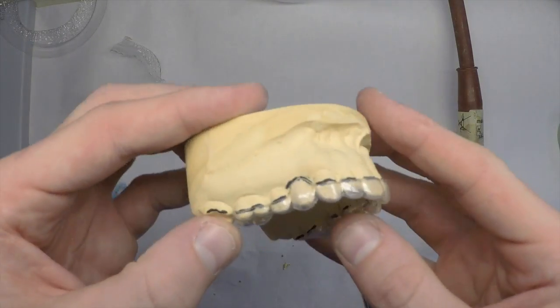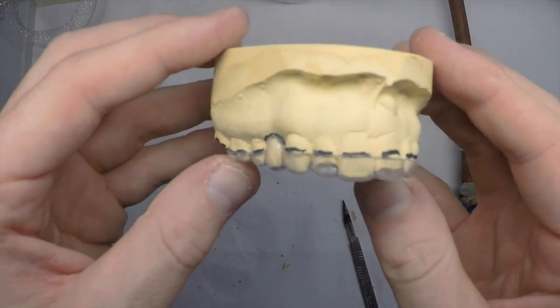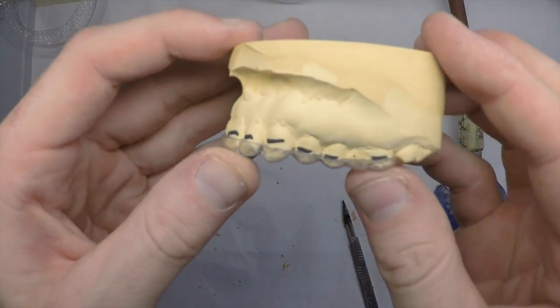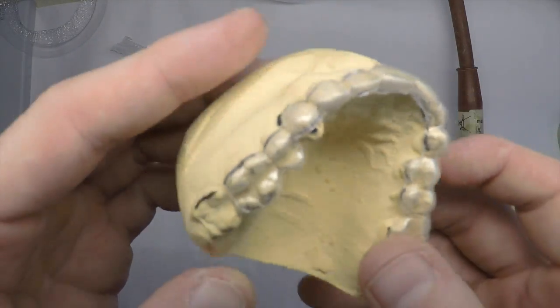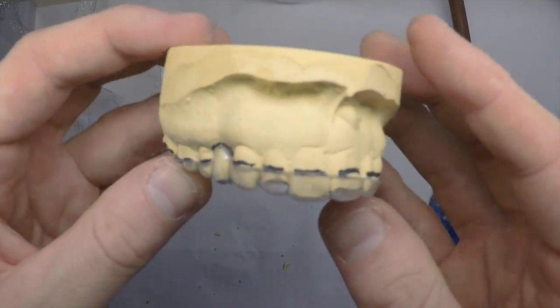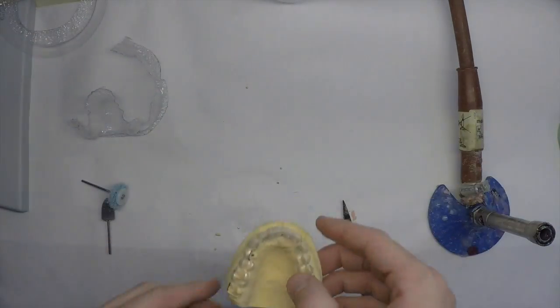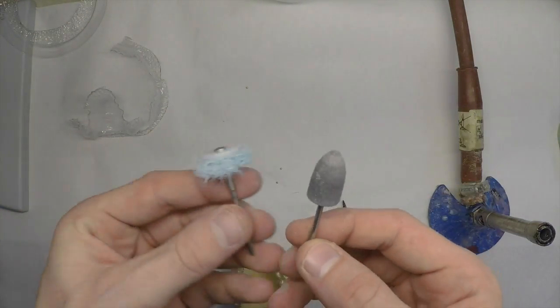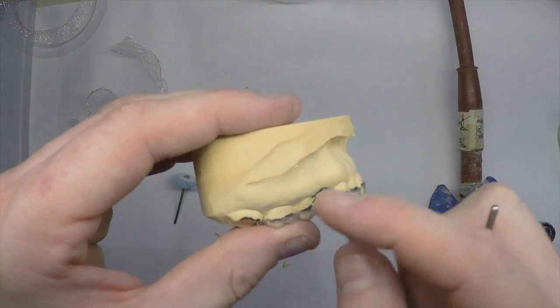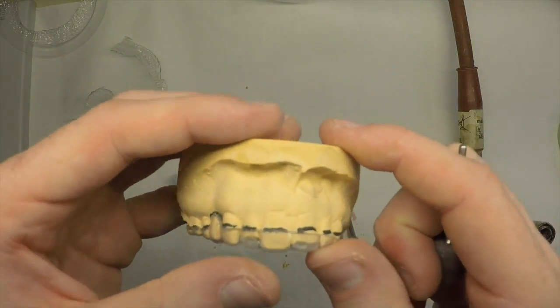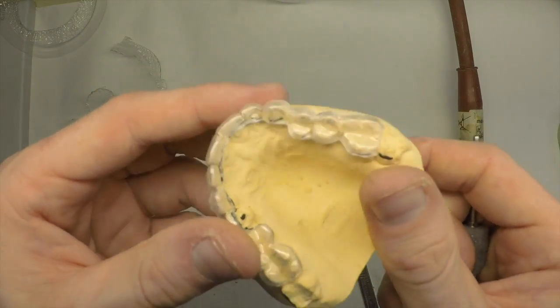Once you've finished trimming, it should look something along the lines of this, which just needs polished. To polish I just use a couple of lab polishing burrs. Although a Christmas tree or a bullet acrylic burr will also work.